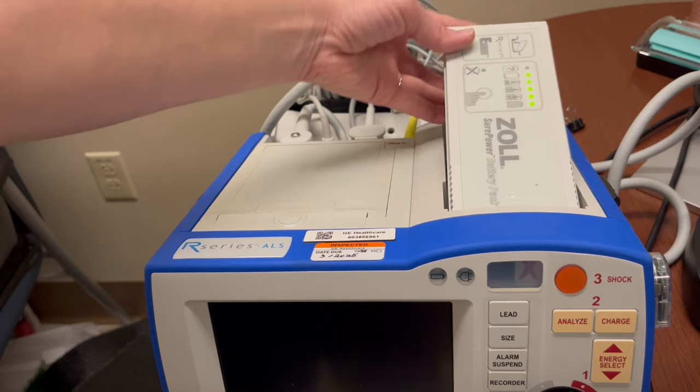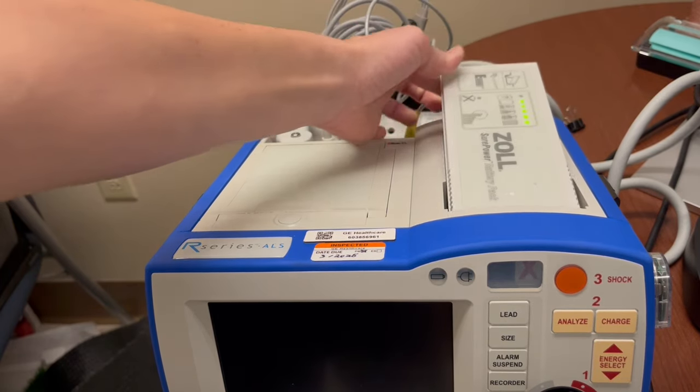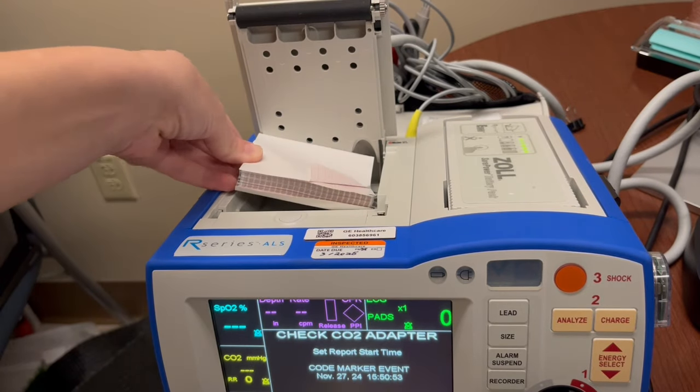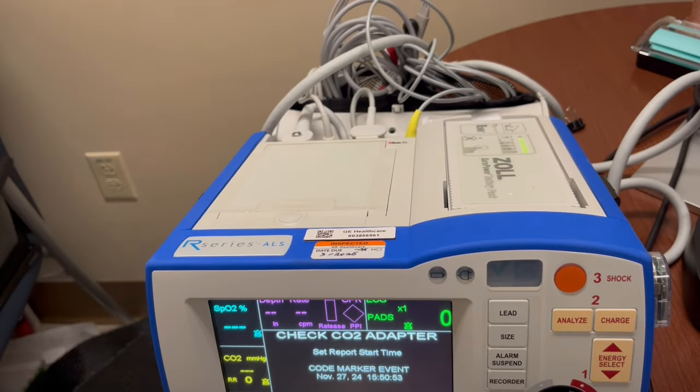On the top of the machine you will find the battery. You can open and change the battery if needed by pushing here. To place paper in the machine, make sure the white side is facing up and that the folded corner is facing your right shoulder, then pull the paper forward so that it's ready to print.